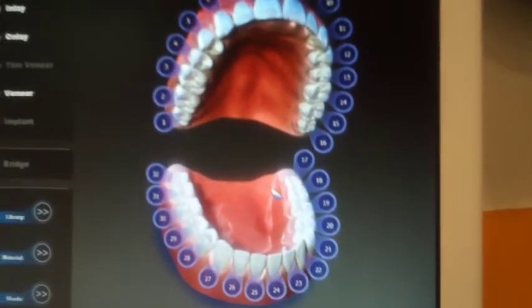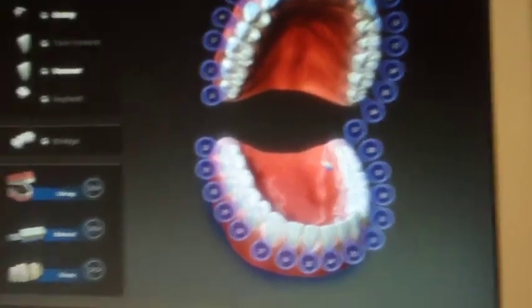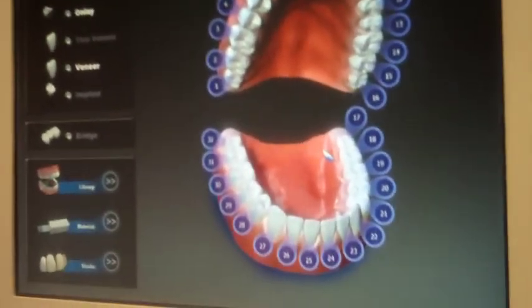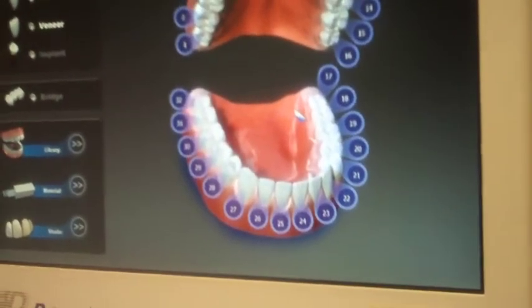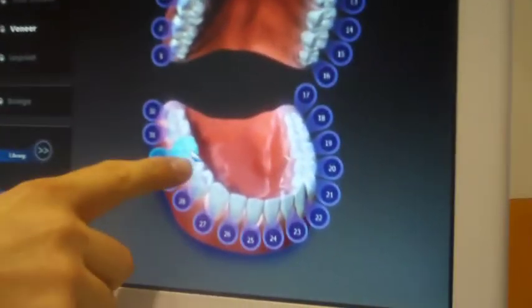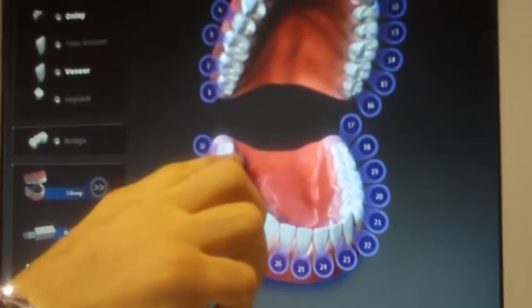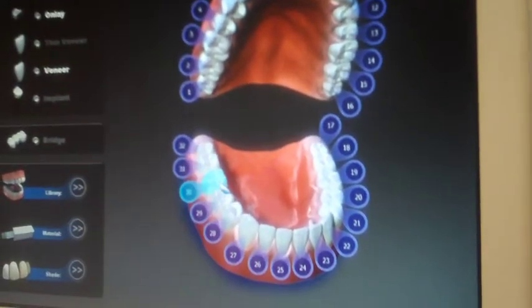First we have to pick the tooth. The whole concept of scanning is that to have points of reference we have to go a half tooth distal and a half tooth mesial. So if I'm working on this model right here, I'm working on a 46 — or number 30 in the American numbering system. So I pick number 30. If I was doing a quadrant I would pick that tooth as well, and then I would select what type of restoration I was doing. The concept is I scan a half tooth from the distal moving forward to the mesial.